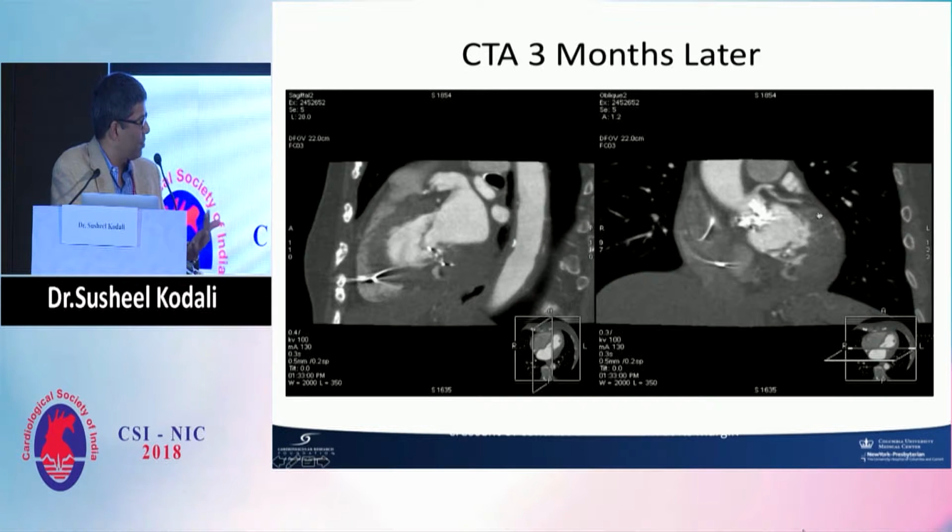So these are all different perforations that we've caused with structural procedures. We've caused perforations in the femoral, in the iliac, in the aorta, in the LV. The key is to be prepared and know how you can manage those without surgery. All were managed endovascularly. So I'll stop there if there are any other comments or questions.